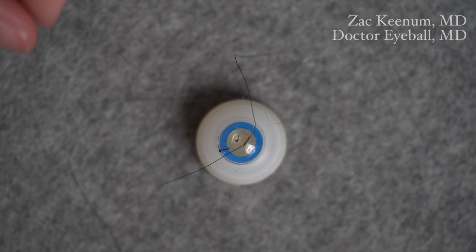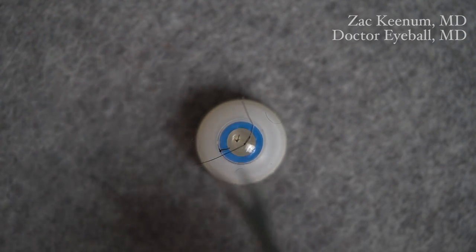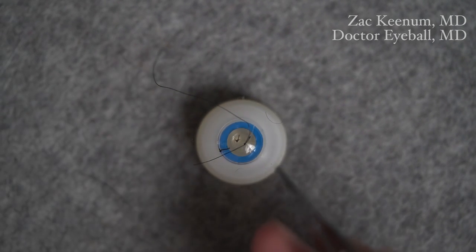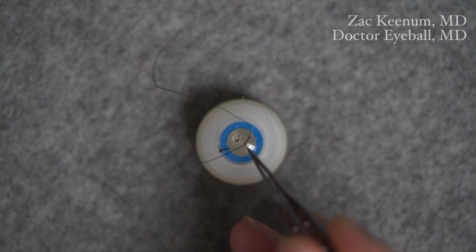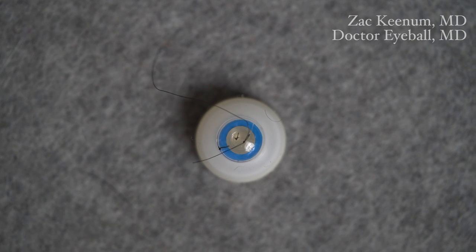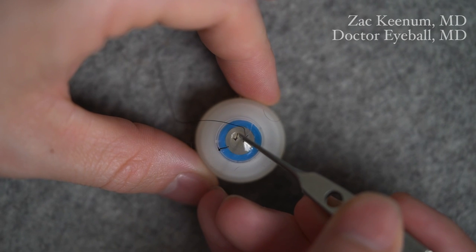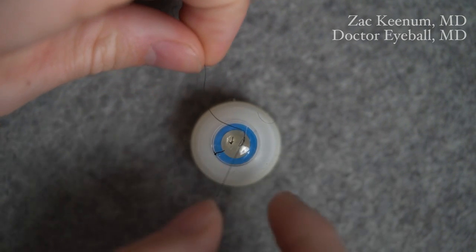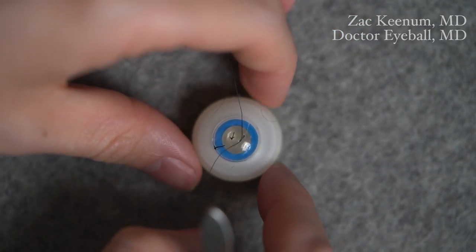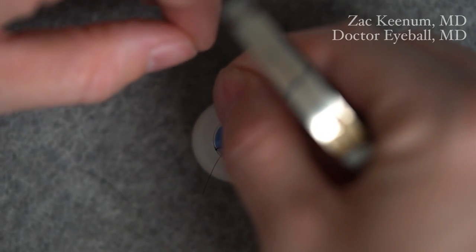This is the adjustable part. If we're doing an open globe repair — say repairing a corneal laceration with multiple sutures needed — I'll leave a long end and a short end to keep us oriented. This suture is still adjustable, so I can proceed with passing more sutures to close the rest of the laceration. Once all sutures are passed, I can adjust the tension as needed — loosen or tighten each one along the course of the laceration. When the tension is appropriate, I'll throw the third throw to actually lock the stitch.